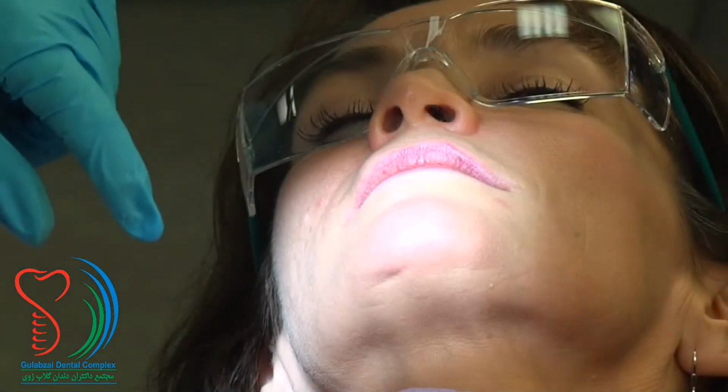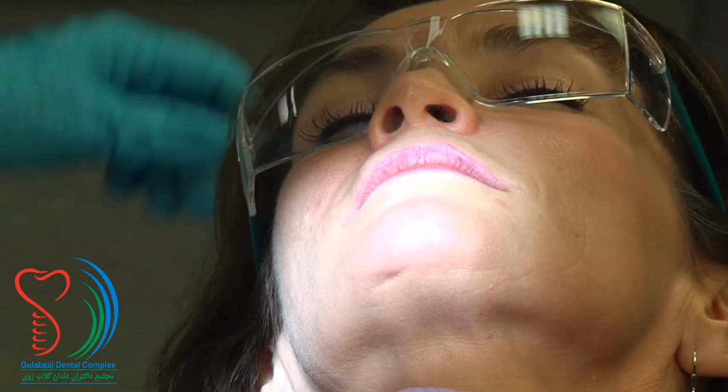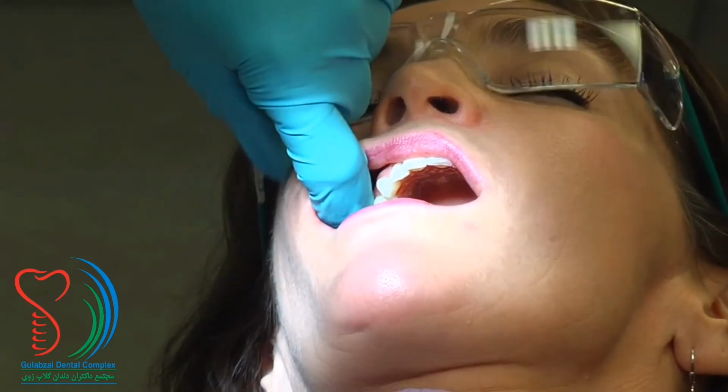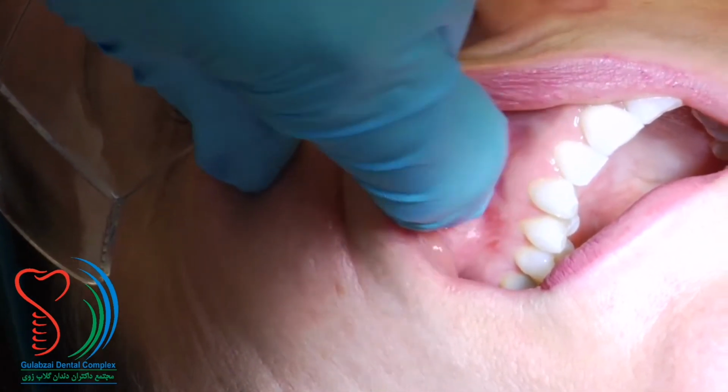The last maxillary injection we'll be demonstrating is the posterior superior alveolar block. Remember, this is a deeper injection and the anesthetic is being placed close to the nerve trunk. With the PSA injection, the patient's mouth should be partially closed. You should have your thumb resting on the zygomatic process, pressing slightly for distraction.